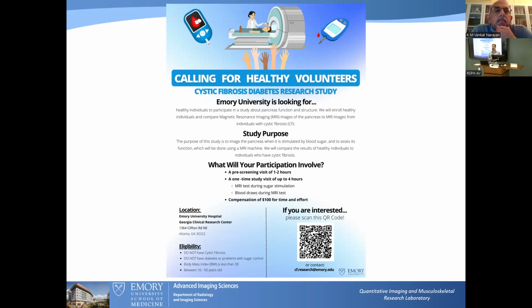But there are already markers that can be used, like O15 water, FDG, and there's others that look at fatty acid metabolism that could be used in combination with the bold imaging, as well as with some of the multi-contrast MRI methods. And I do think that that's a powerful platform for studying this.